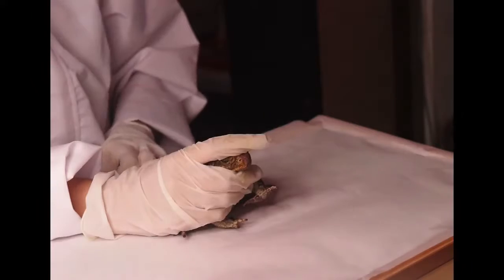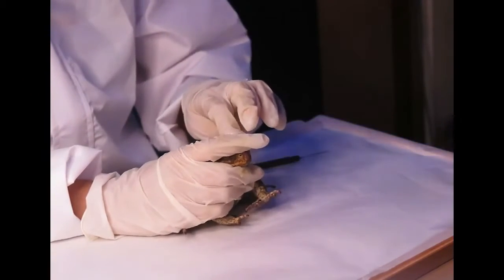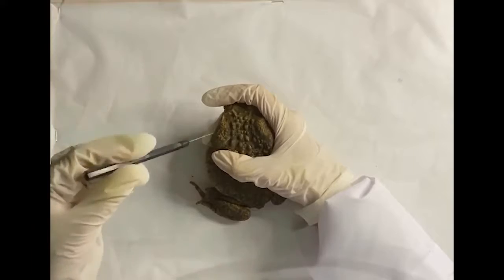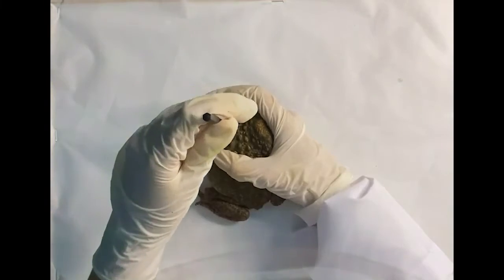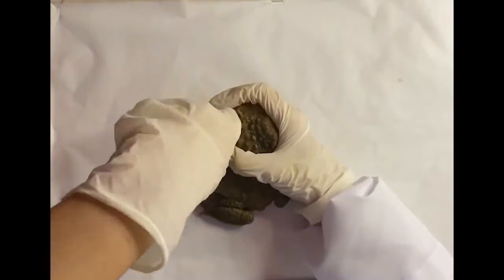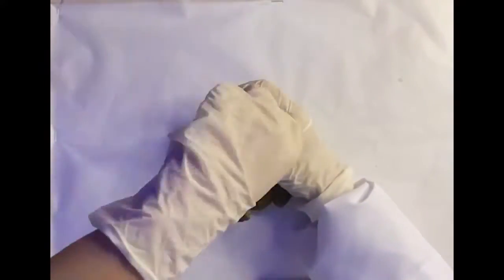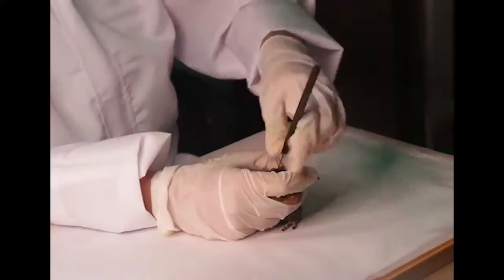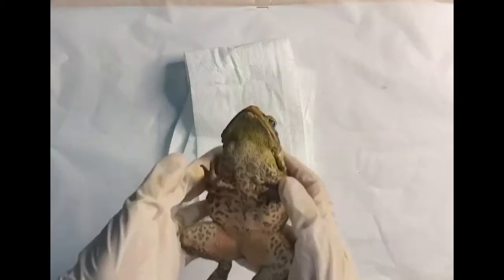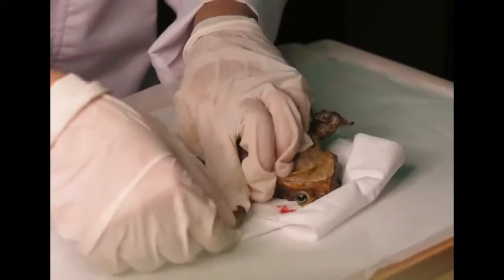Now, by following the instructions, I positioned him properly so that I could locate the soft part of his skull. Now that I've found it, I positioned the probe at a 90-degree angle and inserted it in a rotational manner. Now that the frog is paralyzed, we can now pin him in a supine position onto our dissecting tray.